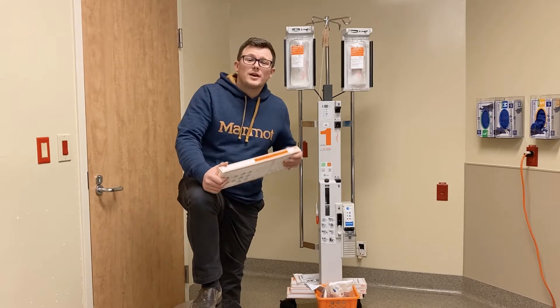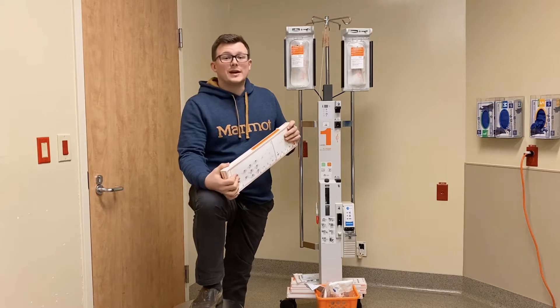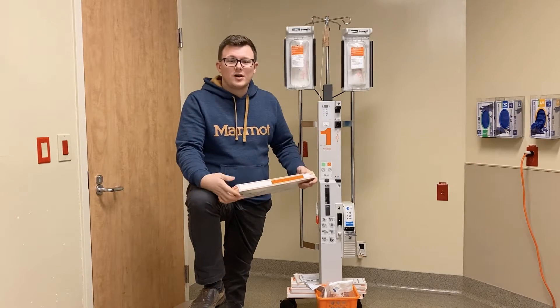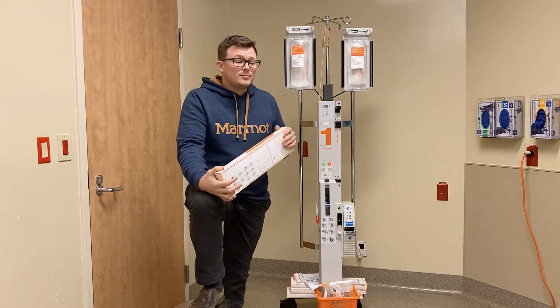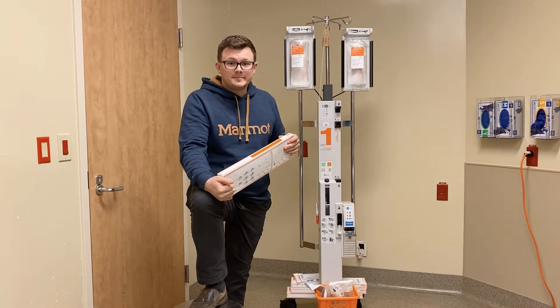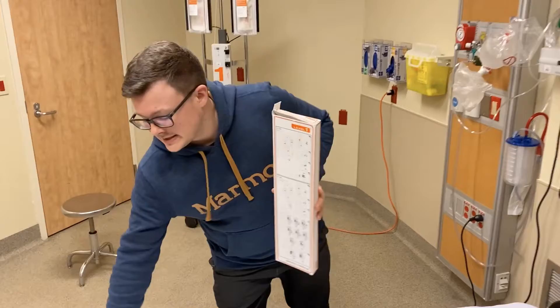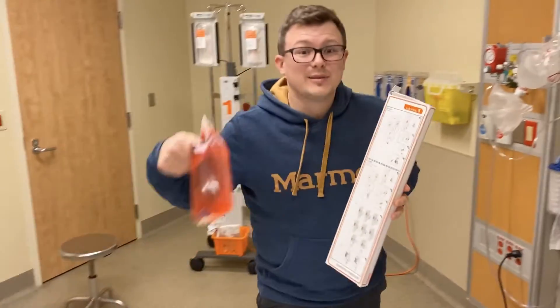We use the Level 1 whenever we want to deliver fluids — particularly blood — quickly. In our department we have a massive transfusion protocol for anyone who might be hemorrhaging or losing blood, and the Level 1 is what allows us to give them the blood they need quickly. There are only a couple of things we need besides our Level 1: our tubing and fluids, preferably warm and preferably blood.